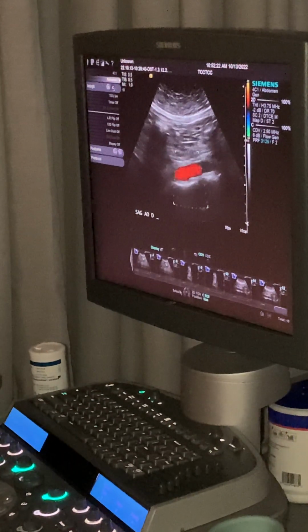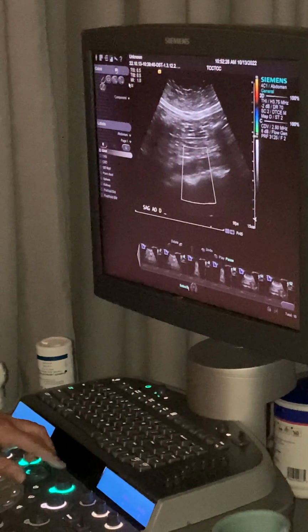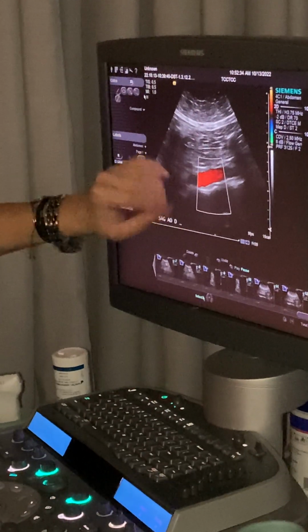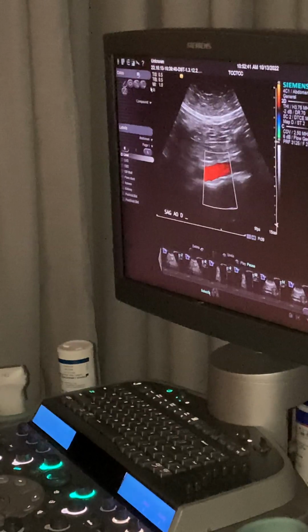And so we are at 48. So you're going to be kind of in the 48, 50 neighborhood, depending on who you're scanning. And we want to make sure our color's filling. Now notice this goes through the box, it's not getting cut off by the box. And we're about a third of our image width. We finally got color. But the sequoias are going to be much better for color.